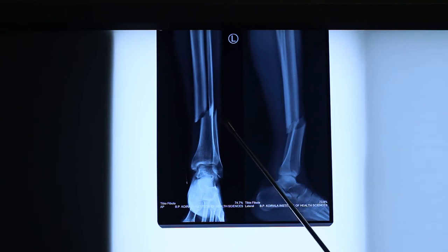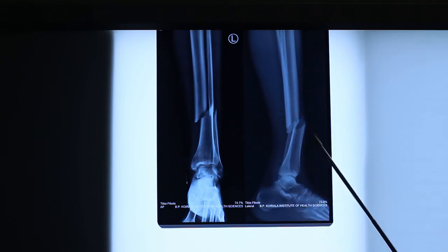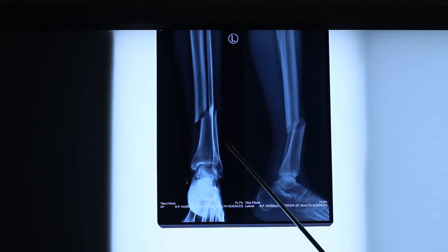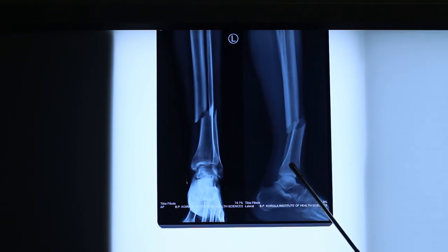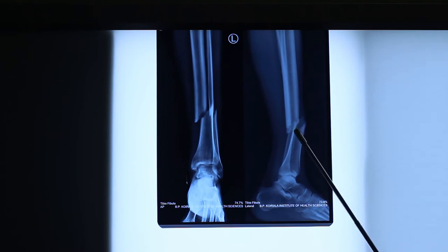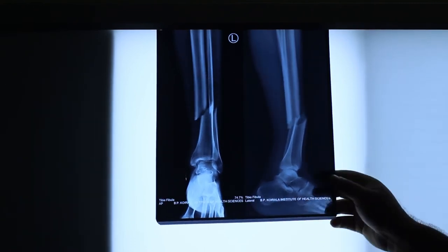So it is a fracture of both bones of the left leg of a mature skeleton at the junction of the middle and distal third, which is displaced laterally and anteriorly with posterior angulation, apex anteriorly. This is how you read this X-ray.